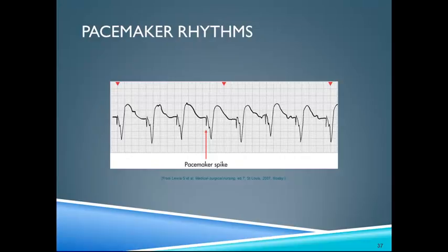Pacemaker rhythms. Sometimes we will do EKGs on a patient with a pacemaker, though not commonly. If they do have a pacemaker, you should see the pacemaker spike as such on an EKG.